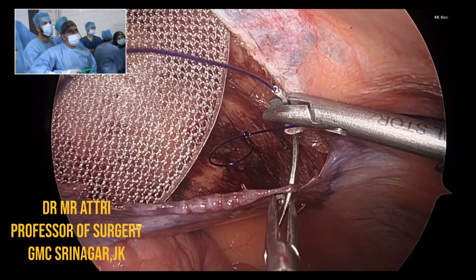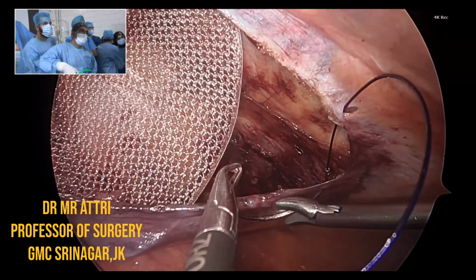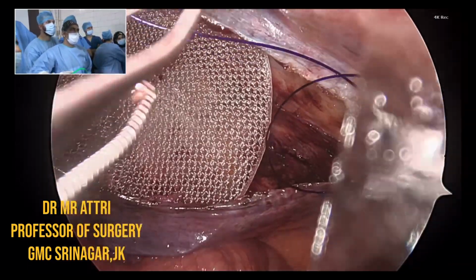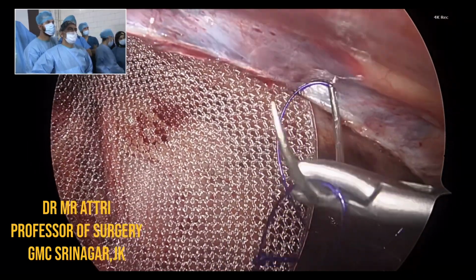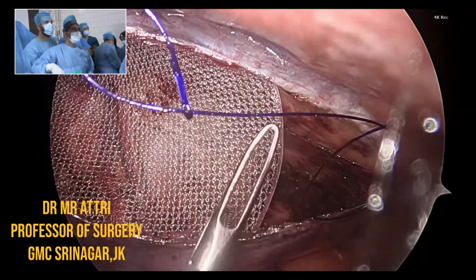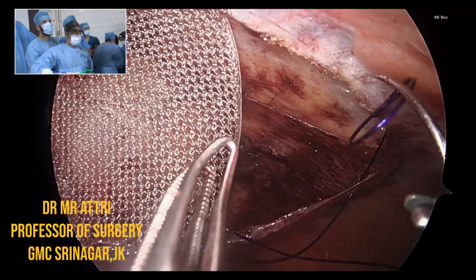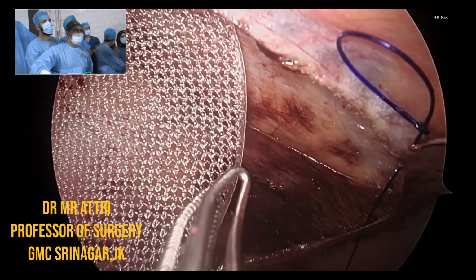Many people just pull the sac out, invert it, and tack it to the rectus abdominis to reduce seroma formation. Seroma formation is a very common problem. We can do it, not only to the rectus; we can fix it to the Cooper's ligament also. The Cooper's we avoid, because if you fix it to the Cooper's, then mesh fixation will be hampered. So fixing it to the rectus abdominis muscle will not hinder the mesh, and seroma will be much less. It definitely helps in reducing seroma formation, sir.